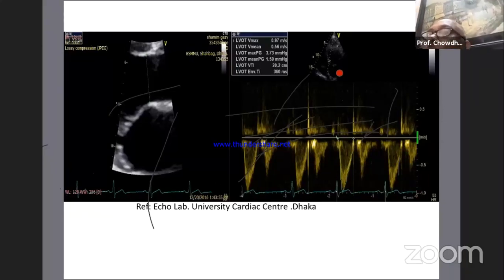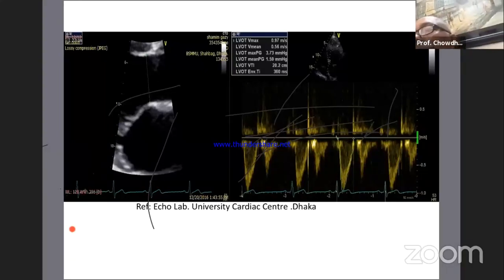So through the Doppler, we can measure the cardiac output and the stroke volume, which is a surrogate marker for left ventricular systolic function. At a time, we are not really sure whether we will give a result of 30 ejection fraction or 40 ejection fraction. Then probably this can give you confidence by cross-checking that probably you are near to normal, if not normal.